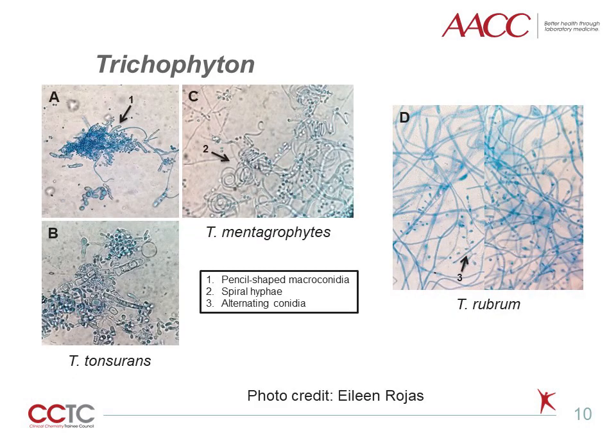The last member of the dermatophytes is Trichophyton. Members of this genus are able to produce a variety of conidia. To show the differences between the selected species, the microscopic images are shown on this slide, and the colony morphologies are shown on the next slide. Once again, these organisms are stained using lactophenol cotton blue.